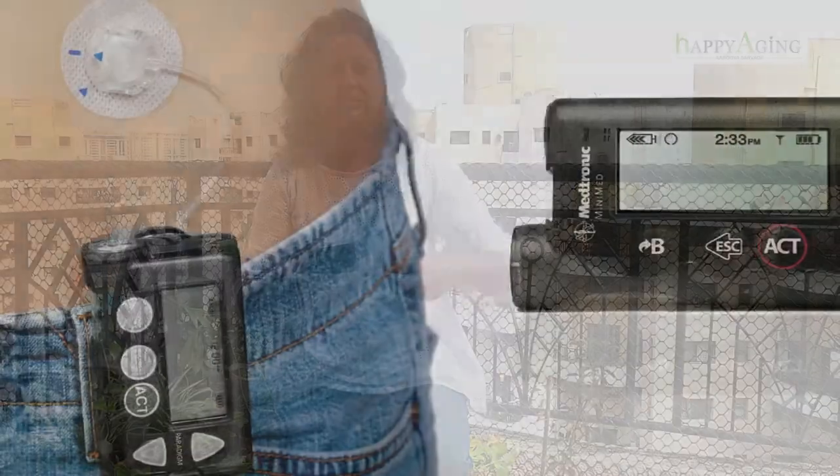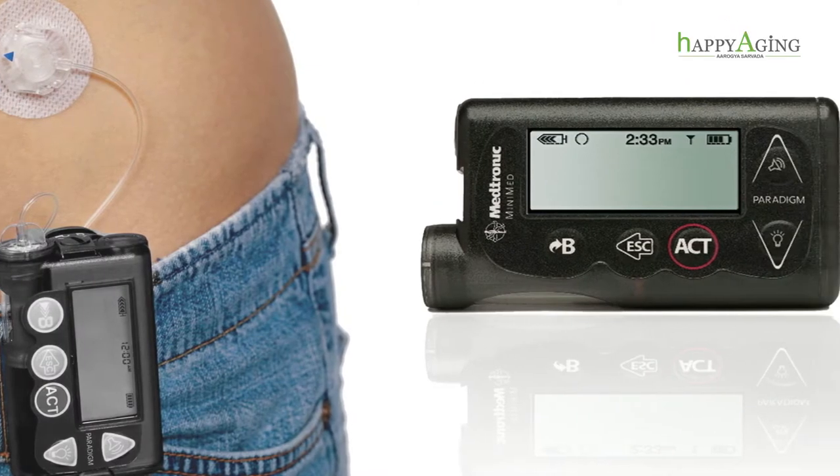Also, a sensor is available with this pump. You can attach the sensor to the other side of the stomach, and you can get readings of sugars on an hourly basis. But I am not using that. It also gives you an alarm — a beeping alert — if your sugar goes high or low.